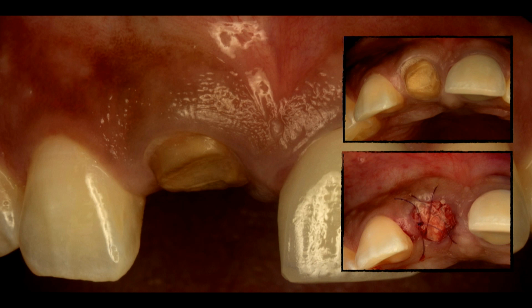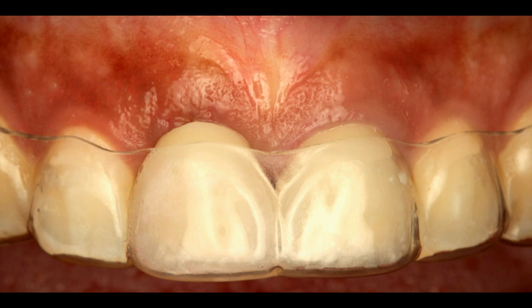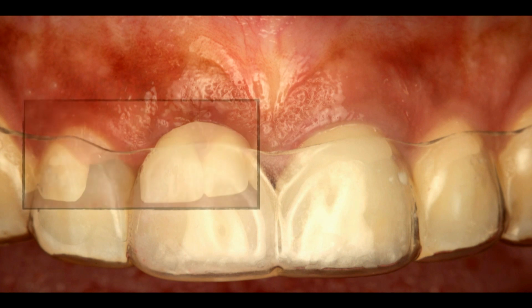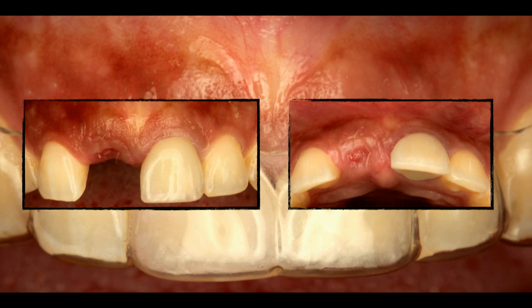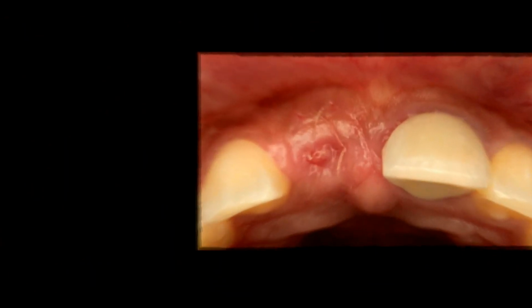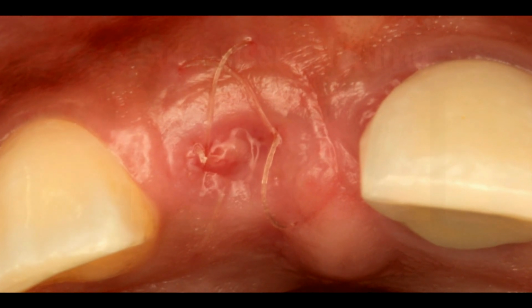That jump gap's usually pretty small. The blood clot stabilizes within the first couple days, and we do pretty well. But now that I know that I have this material that's antibacterial, I will even just put 1 or 2 little sutures here just to hold that in place. Sometimes we'll use an Essex retainer like this as a temporary, but look at that early soft tissue healing. So this is 1 week soft tissue healing, very consistent, like John mentioned. So I mean, that's what we want, really beautiful healing.